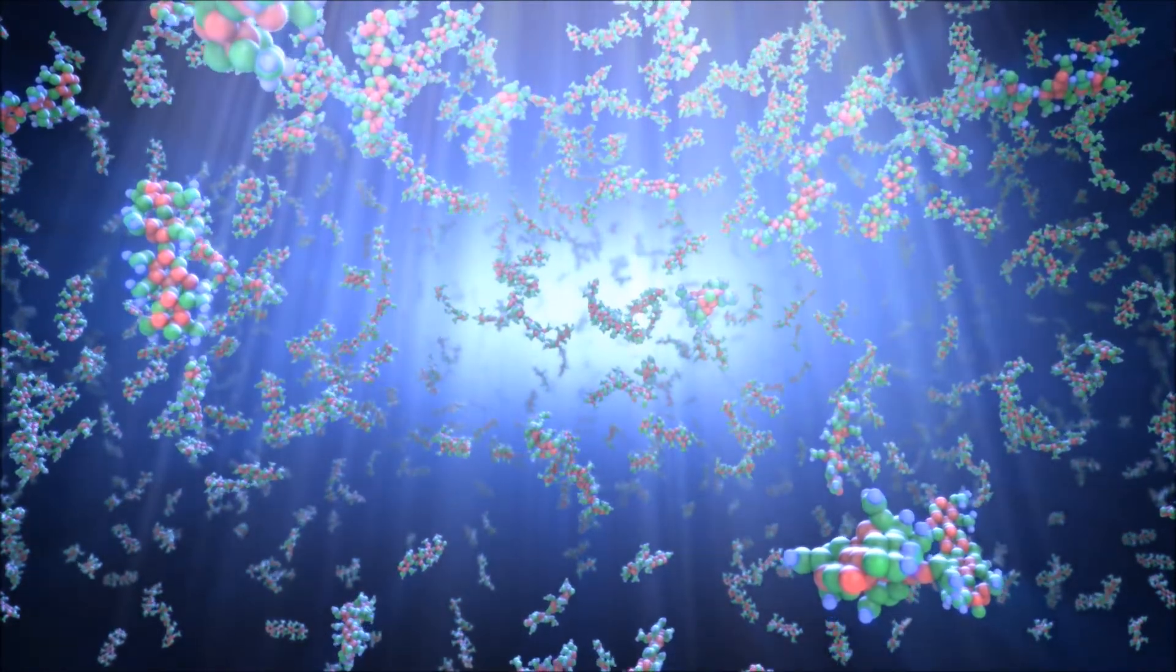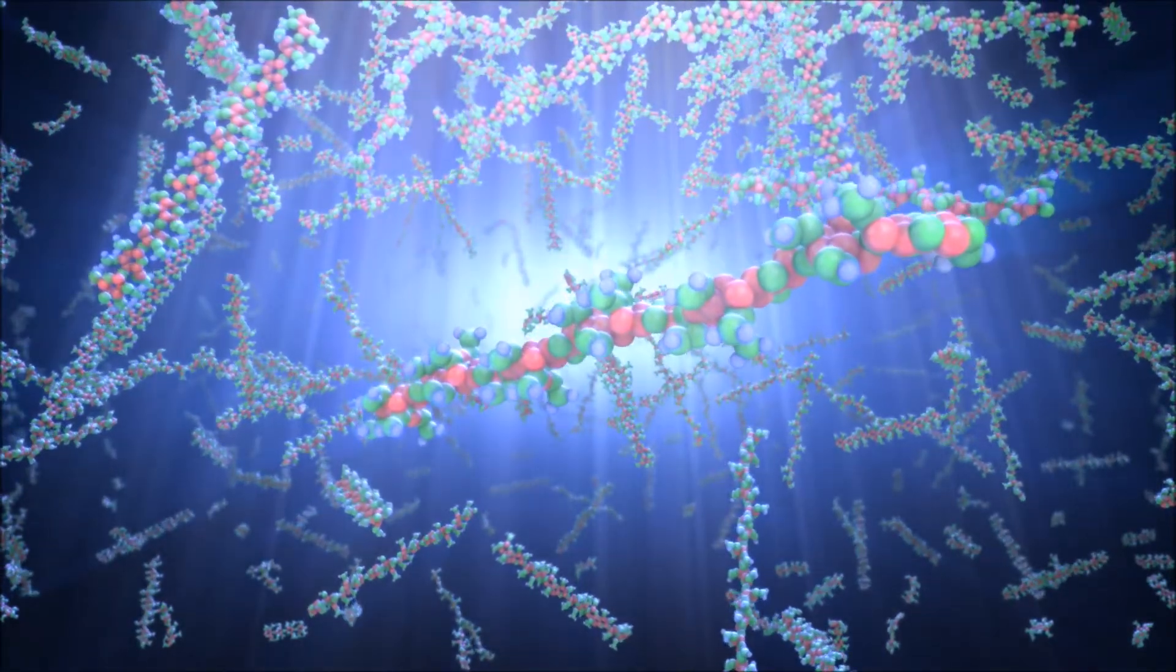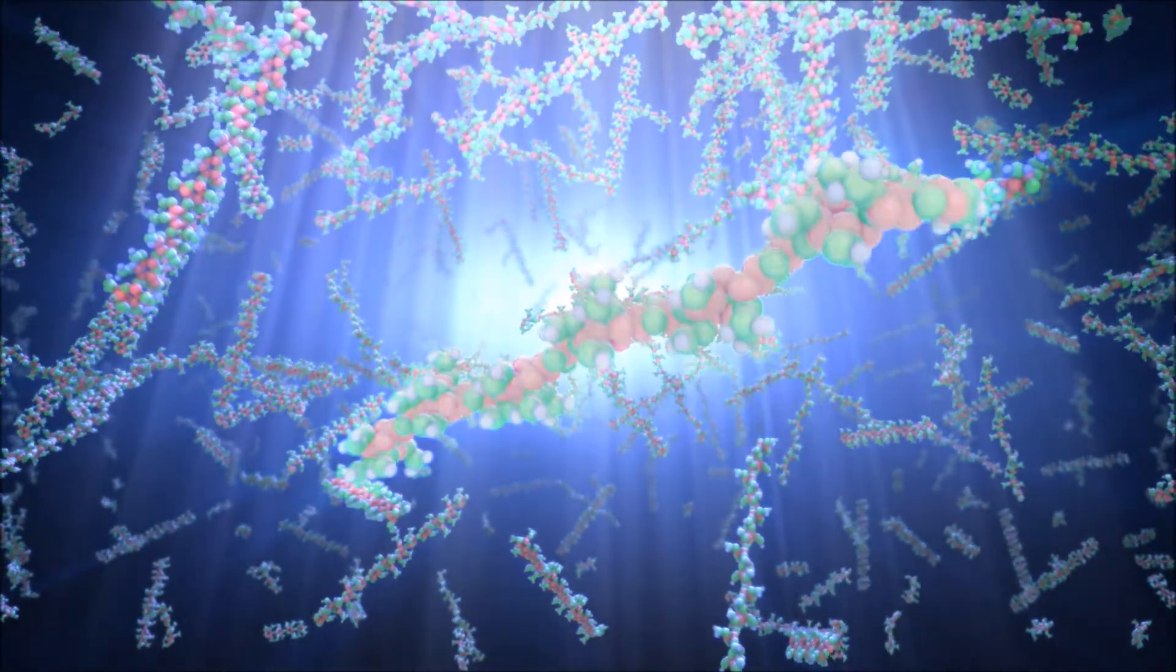When light is directed to a specific area of the lens, macromers in the path of light attach to the ends of other macromers, forming polymers.